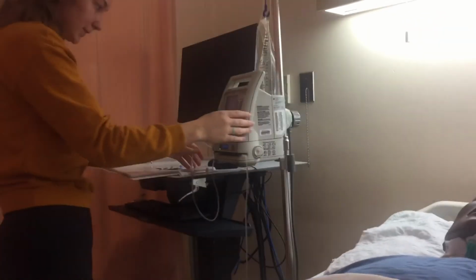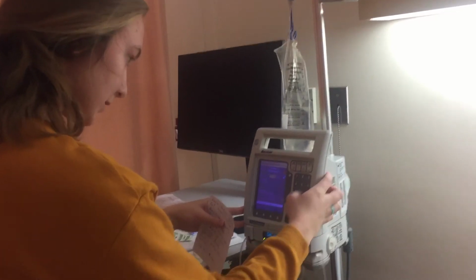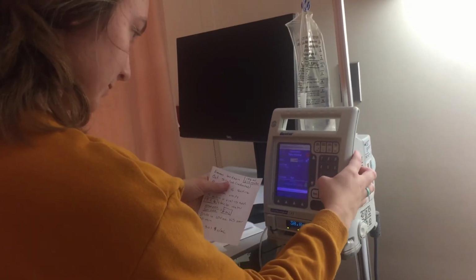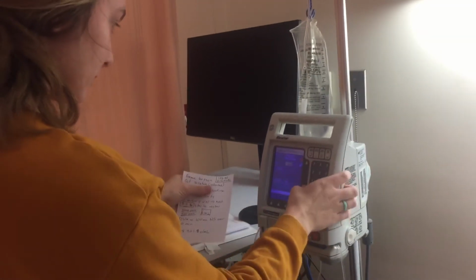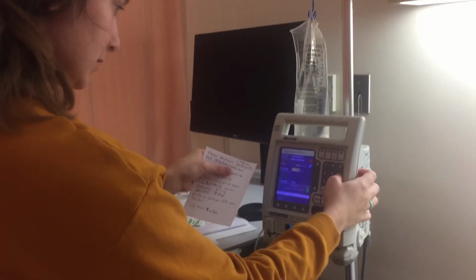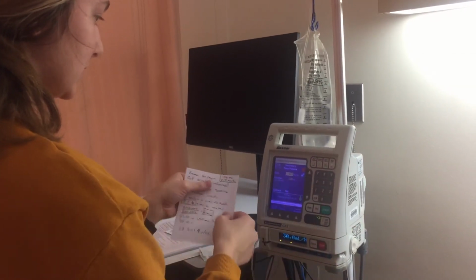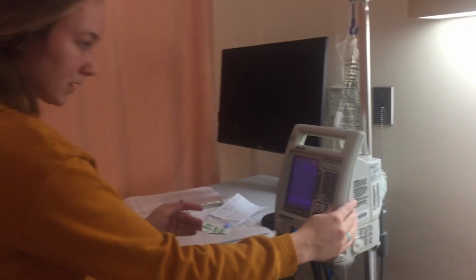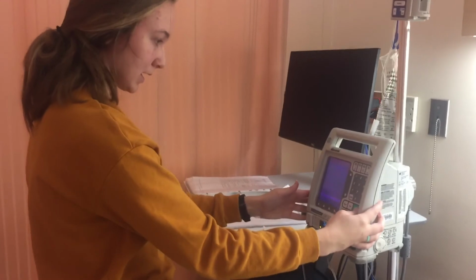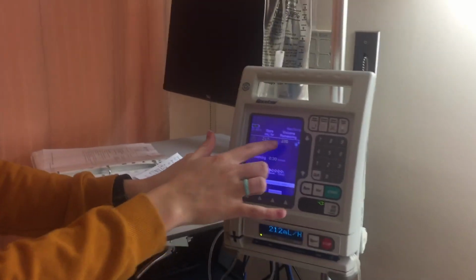So I have done my calculations, and our total volume is 106 milliliters, actually it's 200. So our total volume is 106 milliliters, and we want it to run over half of an hour, so we have 212 milliliters per hour because 106 times 2 is 212. So now I'm going to confirm secondary, and I'm going to press start. So the secondary line has started, and we have the volume and the right rate.